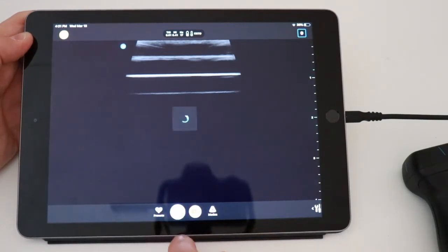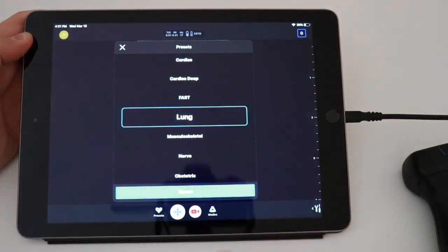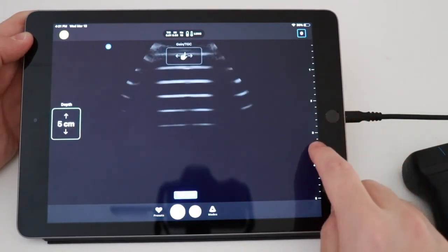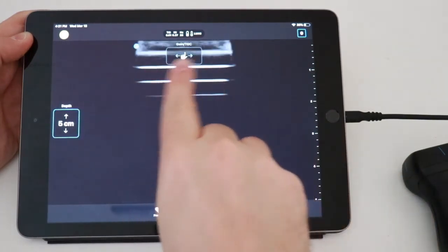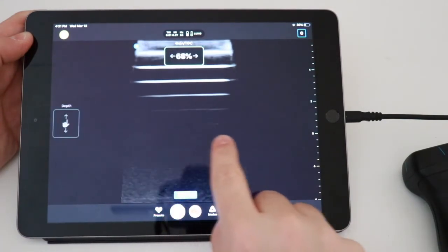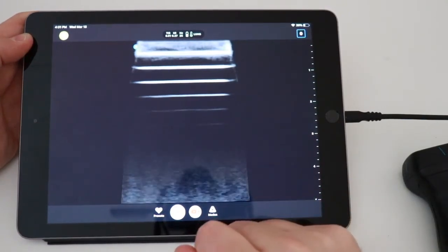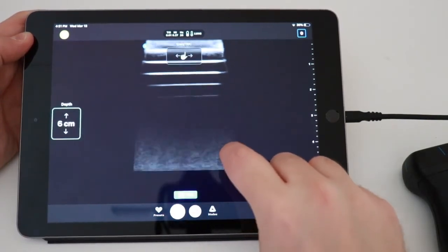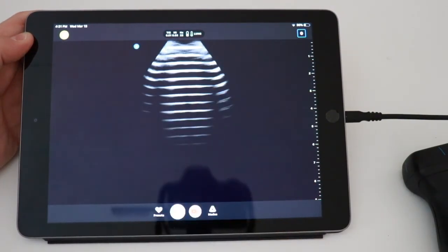For lung exams, we're going to go over to lung presets. We're going to go to lung real quick. And lung, if we're really interested in only the pleura, if we're using a standard ultrasound, we typically use a linear probe. And so if I go really, really shallow, only a couple centimeters, it'll make it look like a linear probe. Again, I can change all this stuff. Now, if I increase the depth on a standard ultrasound, I'm actually going to change over to either a curvilinear or phased array probe. But look what happens with this. If I increase the depth, it automatically changes to something that looks more like a curvilinear probe, which is the type of probe that I would be using on a traditional ultrasound.